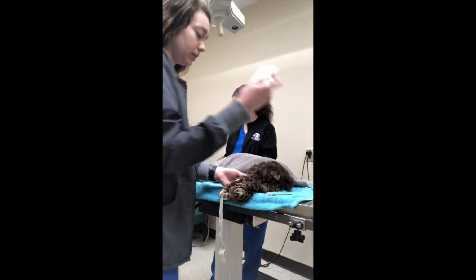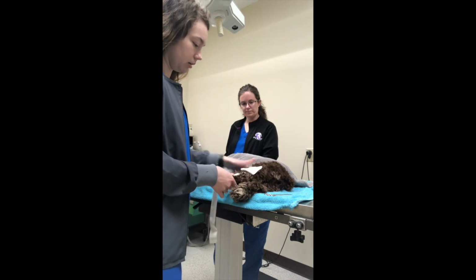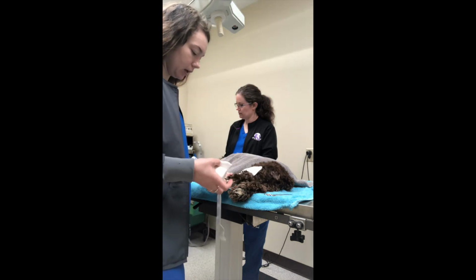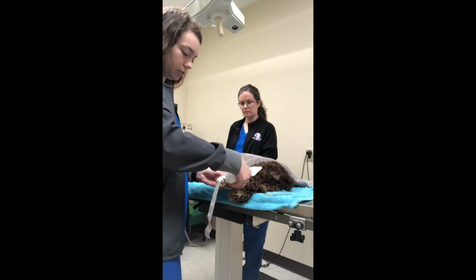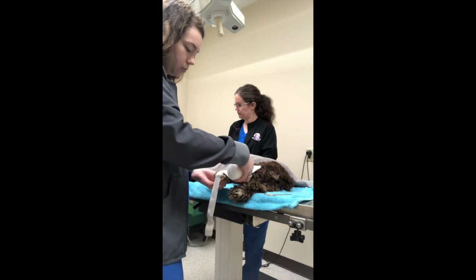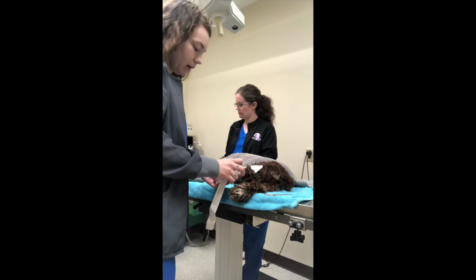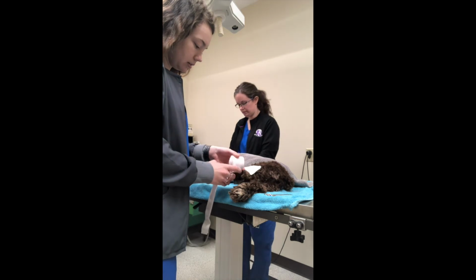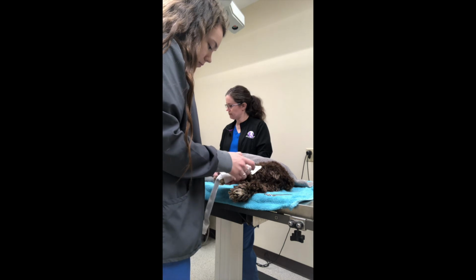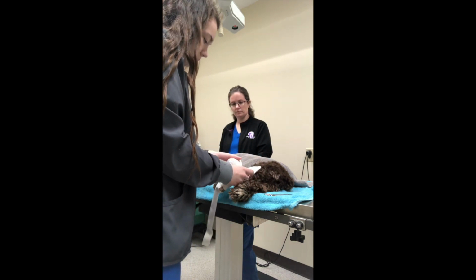And then for the purpose of the video, if she were to have surgery, I would place a piece of gauze on the surgery site. And then I'm going to start with cast padding, and I'm going to start just above the toes. You do want to make sure the tip of the toes is outside of the bandage so you can observe it for any swelling. And I'm going to wrap overlapping about 50%. Making sure not to have any creases in the bandaging.